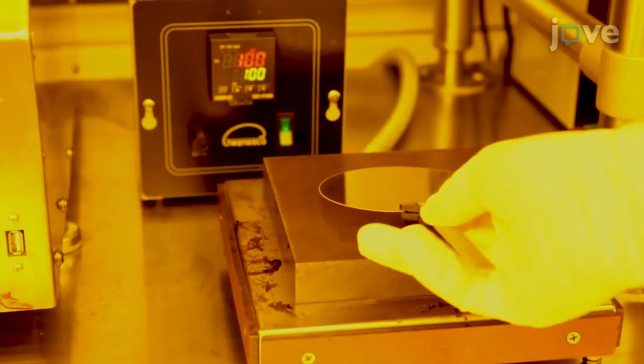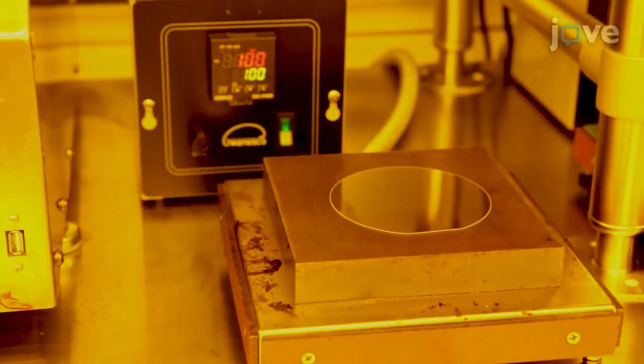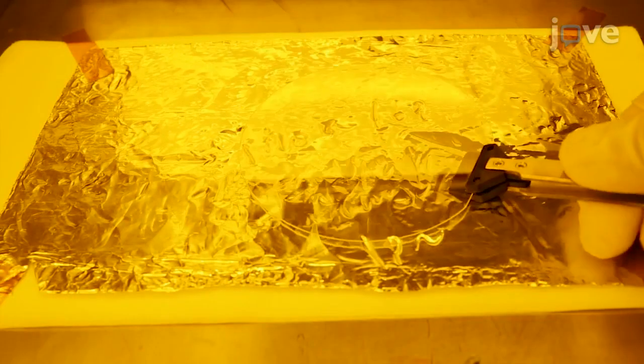To pre-bake the wafer, place it on a hot plate at 100 degrees Celsius for 3 minutes, then move the wafer to aluminum foil.